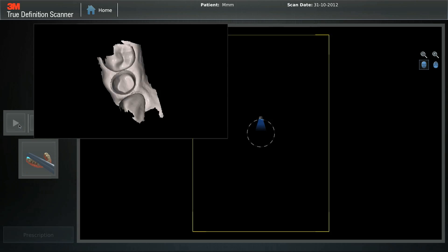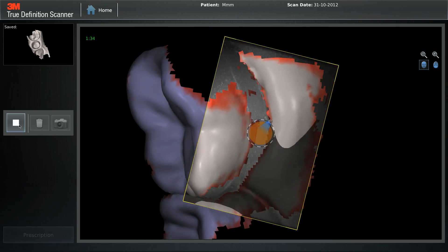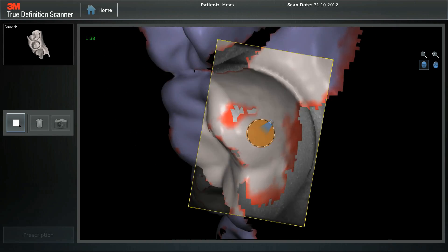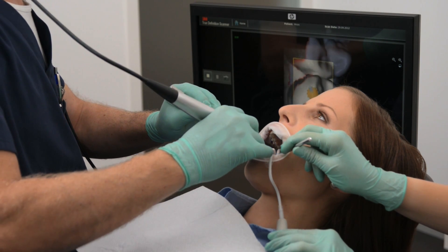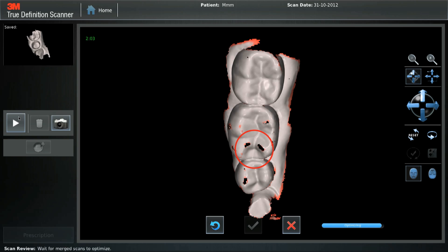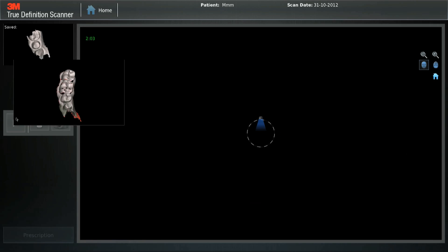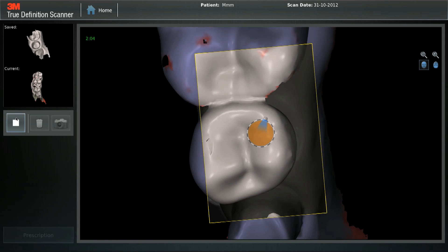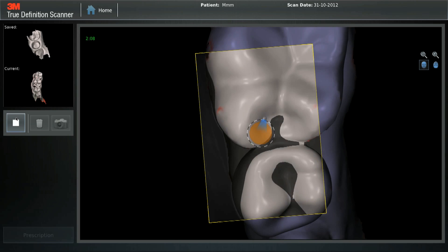Patching Scans. To add the rest of the arch, start on a surface previously scanned. Previous scans are displayed on the top left corner. Follow the scan path seen in previous tutorials. Before saving data, patch any holes seen immediately. The previous two scans are shown on the left, and we can quickly patch the few occlusal holes seen.